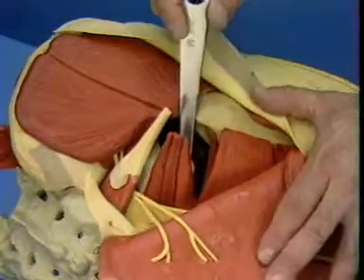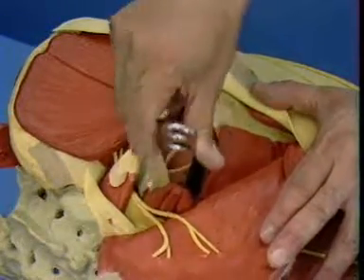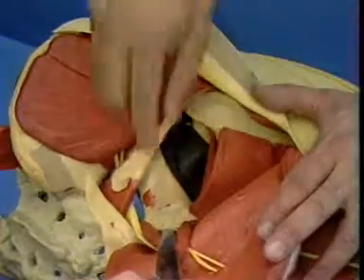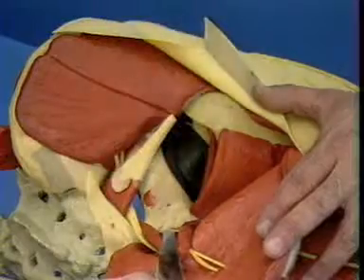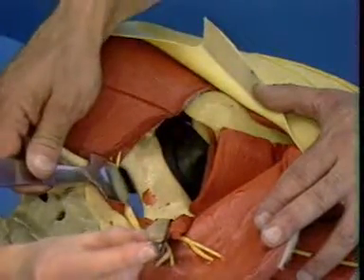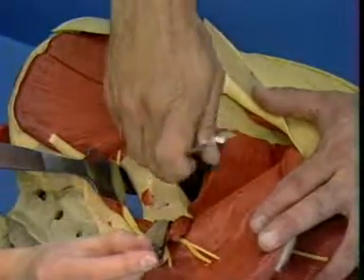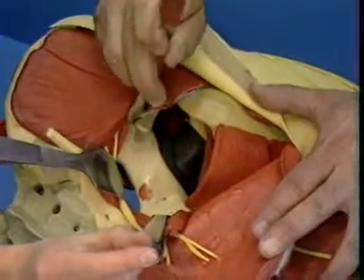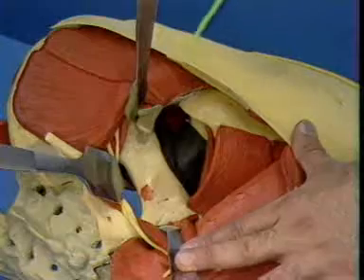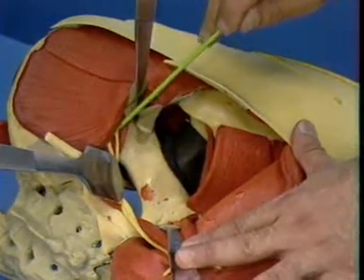A Hohmann retractor is placed into the lesser sciatic notch, retracting the obturator internus muscle and the sciatic nerve posteriorly. The sciatic nerve must be palpated to make sure that the tension is not too great. A second retractor can be placed into the greater sciatic notch, retracting the piriformis muscle. A Hohmann retractor can be placed with the tip driven into the inferior iliac wing. Care should be taken not to stretch the superior gluteal nerve.